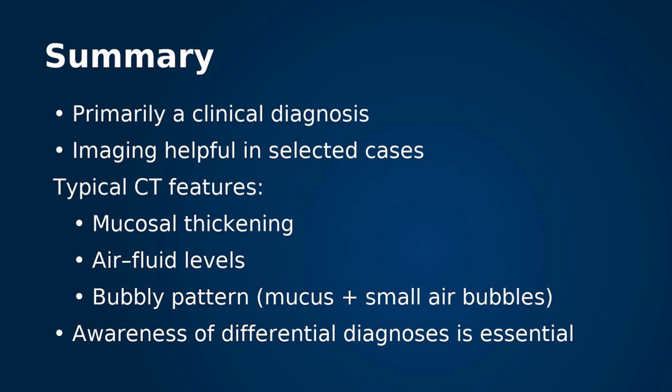In summary, acute sinusitis is a clinical diagnosis, but imaging can provide crucial information in selected cases. On CT, the presence of mucosal thickening, air fluid levels, and the bubbly pattern are the most typical findings, and knowledge of the differential diagnoses is essential to avoid misinterpretation.